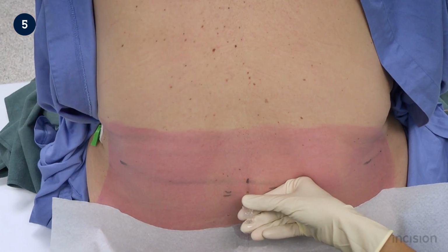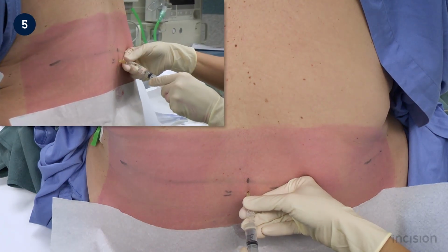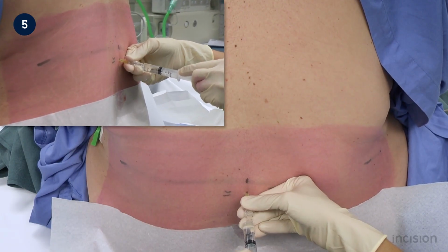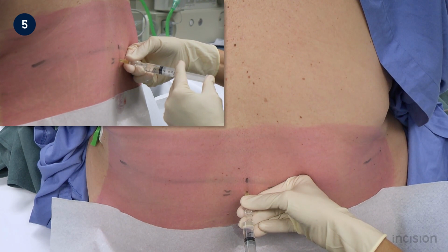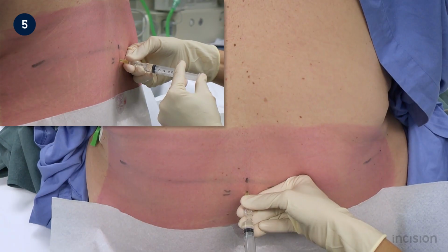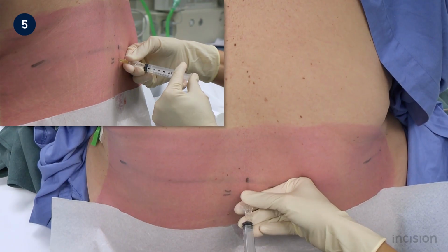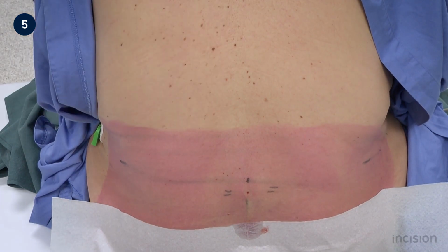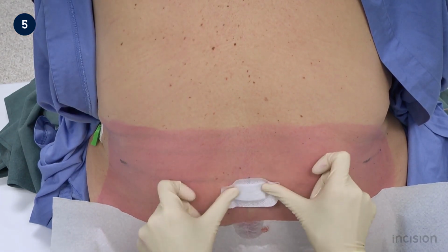Before injecting local anesthetic, the non-dominant hand stabilizes both the needle and the introducer. This prevents potential movement of the spinal needle out of the subarachnoid space. Once attached, the plunger is pulled back and a small amount of CSF is aspirated, confirming the needle is still in the subarachnoid space. The plunger is then pushed in slowly and steadily. Injecting quickly may result in a higher than intended spinal block. The introducer, spinal needle and syringe are removed as a single unit once injection is completed. A sterile dressing is applied to the injection site.